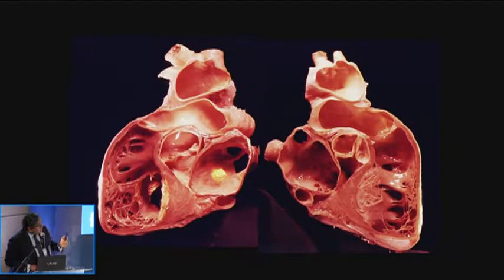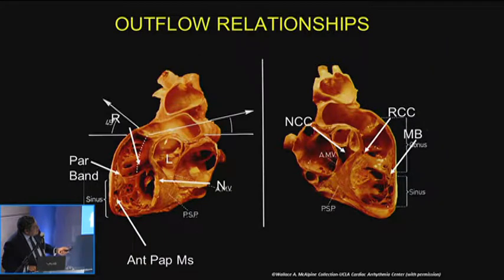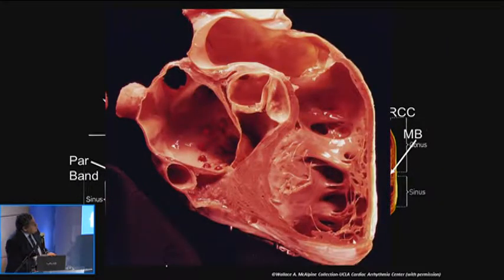This is another beautiful section which I particularly like because this is slicing the heart on the RVOT. And what you're going to be seeing over here is this is actually the right cusp. And this muscle that goes around the cusp is where we do the mapping, shown in higher magnification. This is the area that you're mapping. So it sort of wraps around. And sometimes you may not be able to map this area from the IVC, so you may even have to put up a Mullins sheath into the RV so that you can turn on yourself and sample these areas better.